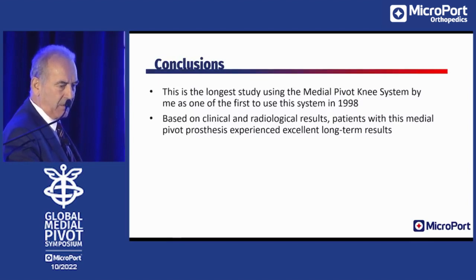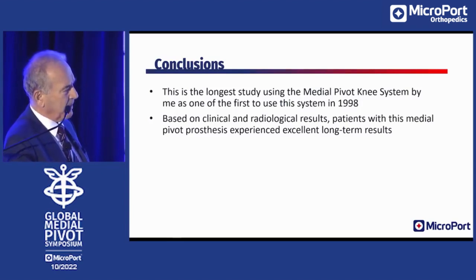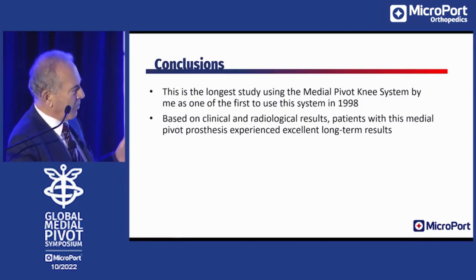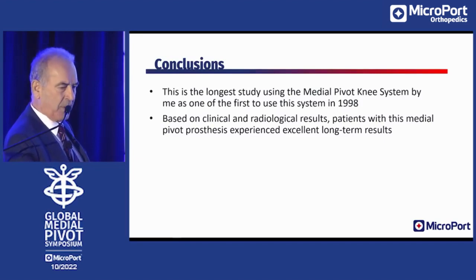And in conclusion, we believe that a medial pivot, it is an excellent solution for total knee replacement. This is a long series, and throughout the years, we have learned that we should keep the medial compartment tight. We should have the knee a little bit looser in flexion, but we should keep in mind that throughout the years we learn how to use the medial pivot concept, and today we have all the details and many data to have even better results for the future. I thank you for your attention.